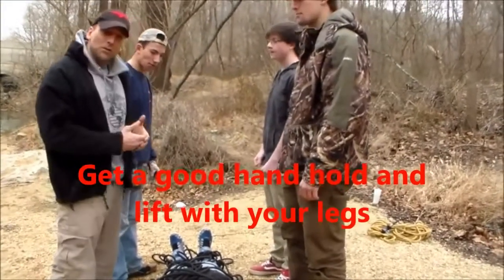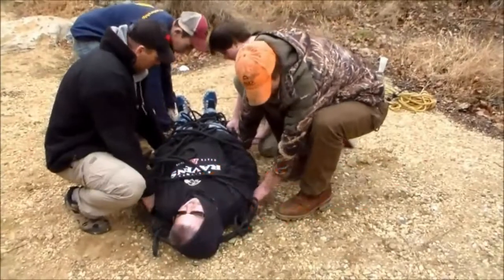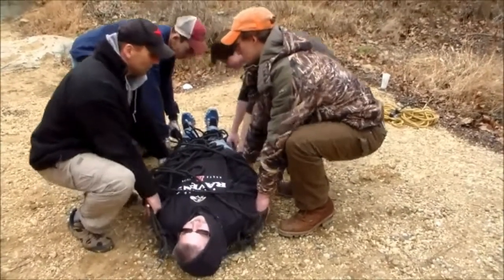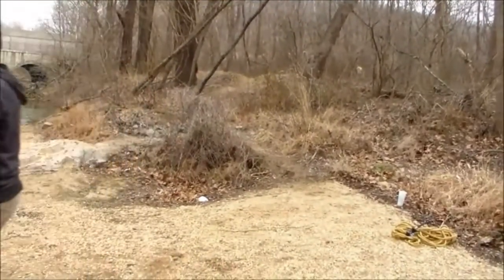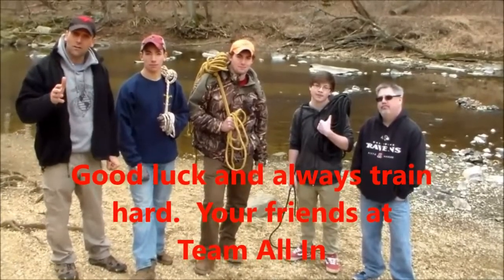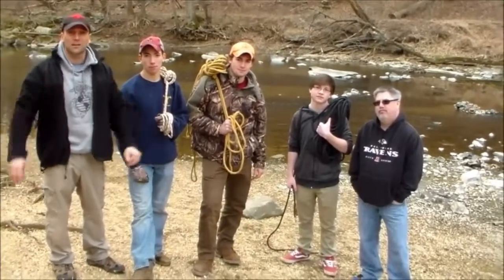The last piece is picking up our patient, keeping in mind that he's injured and we don't want to cause further injury. Grab the side handles and lift on three, lifting with your legs — one, two, three — and then safely carry him off. That's how you make a stretcher out of a rope. We look forward to seeing you at the 2017 Klondike Derby. Remember boys: practice, practice, practice.